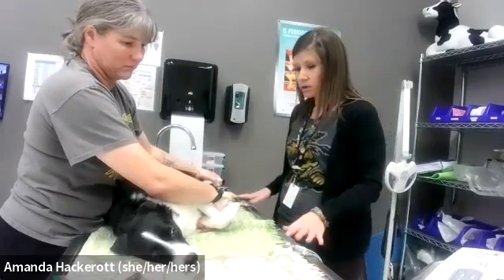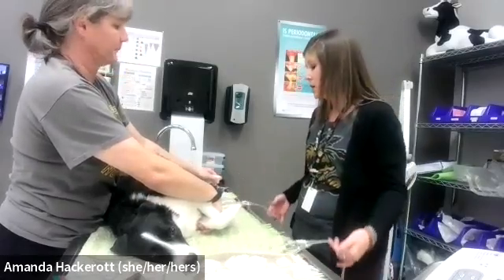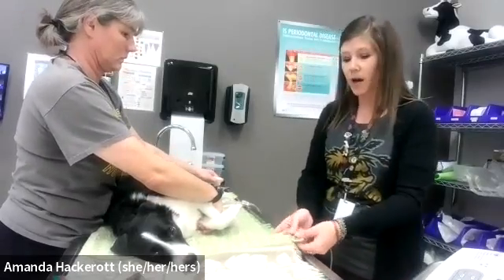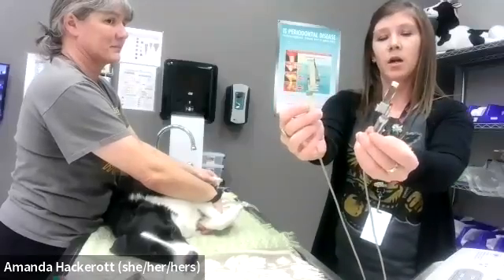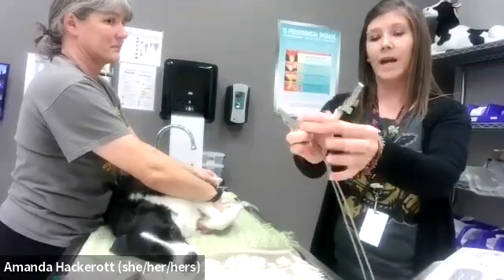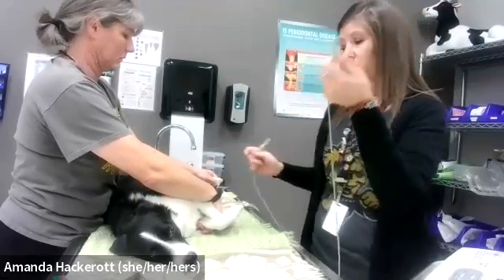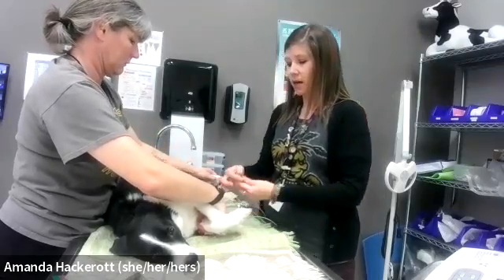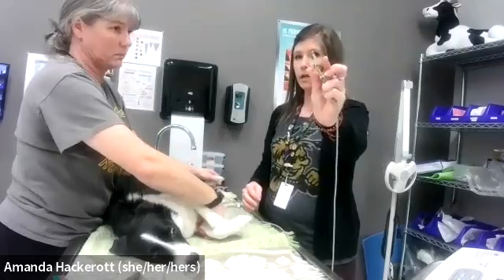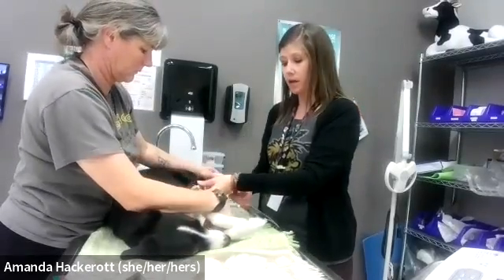We have our four leads. I like to just go ahead and set them up on the table. You can see we have our black and white lead — this is our newspaper. I always start with the white, and this is going to go on the right arm. We're going to place this just up in the axillary area, and we'll place the black lead on the left axillary area. Remember, that's the armpit.